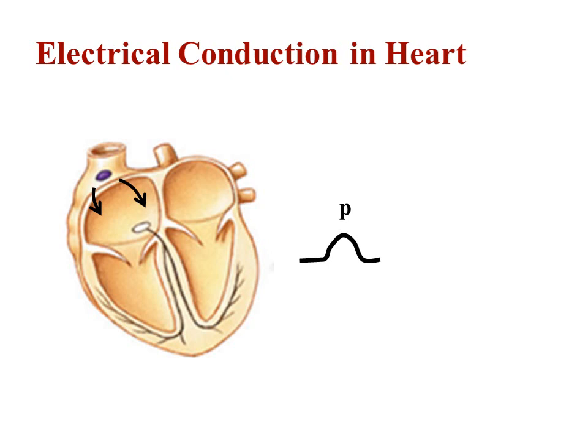In the ventricles there are multiple currents. The first current is from the left to the right through the mid portion of the interventricular septum. This current gives us the Q wave. Then depolarization moves toward the apex. This current gives the R wave.